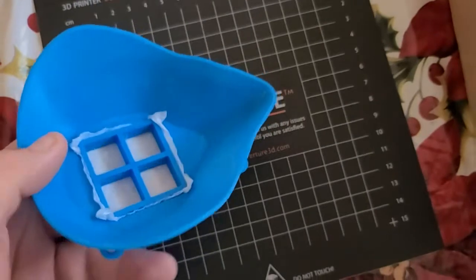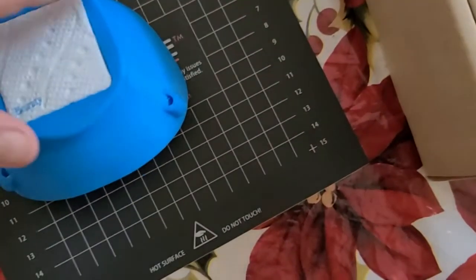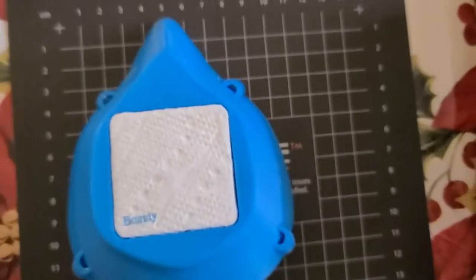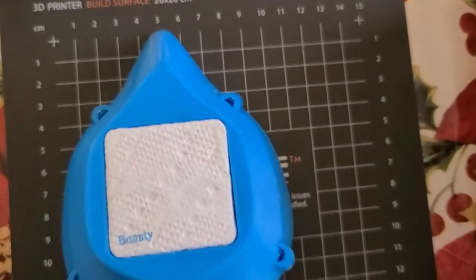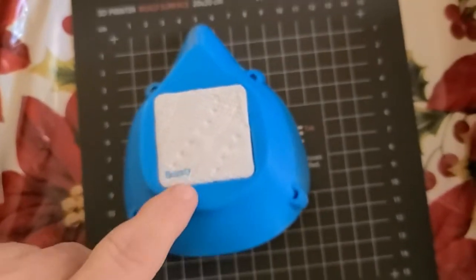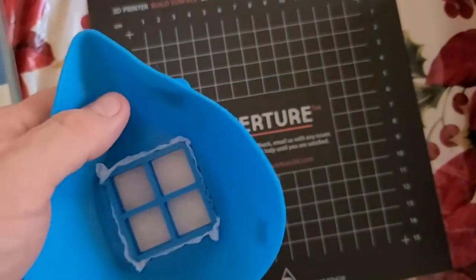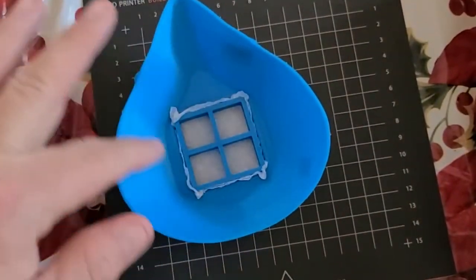They're reusable. This is printed at 100% scale. My nose hits the inside here if I push it all the way in, but once I get the weather stripping around there, probably not.